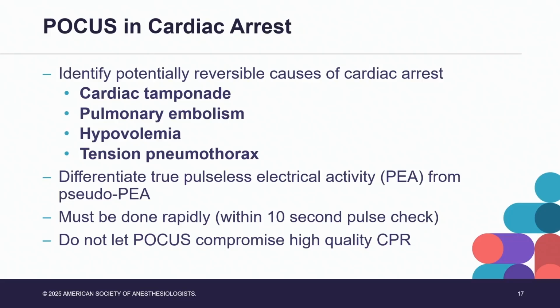So pseudo-PEA is when, on ultrasound, you actually visualize some cardiac motion, but it's in the absence of a palpable pulse. And the literature would suggest that the presence of cardiac activity on ultrasound, or pseudo-PEA, has a higher likelihood of achieving ROSC, or return of spontaneous circulation.